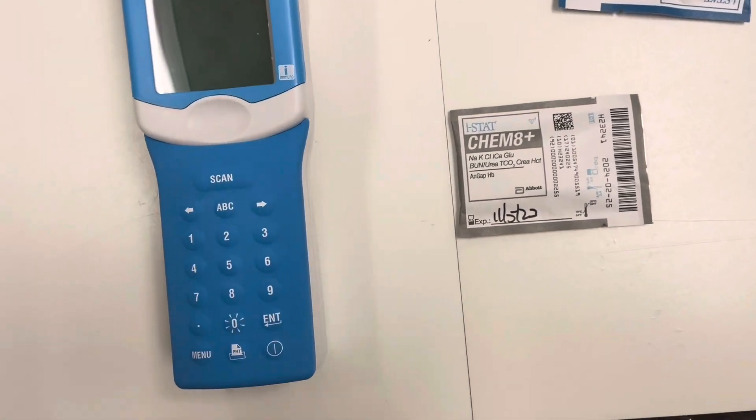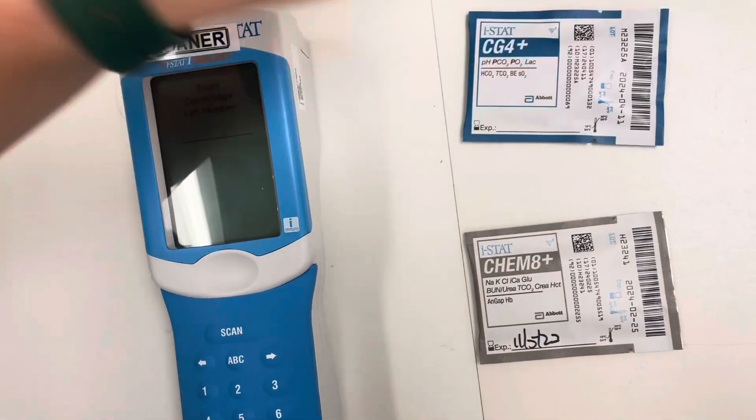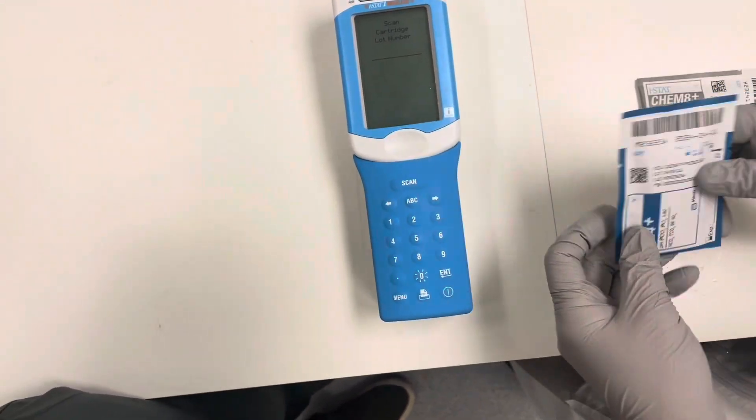Our Chem 8 is going to be our BMP, where our CG4 is going to give us our lactate results. We are going to want to run the lactate first if you have one iStat.